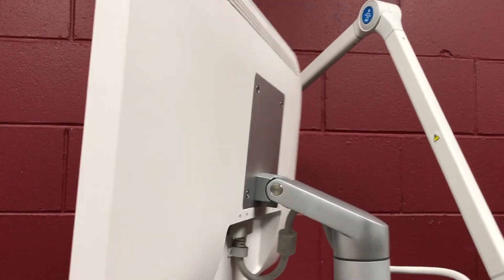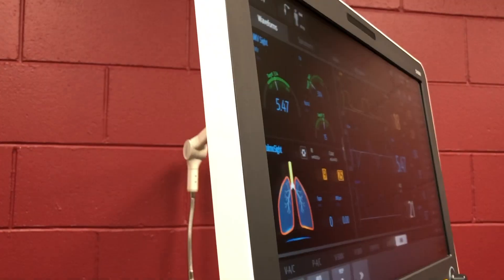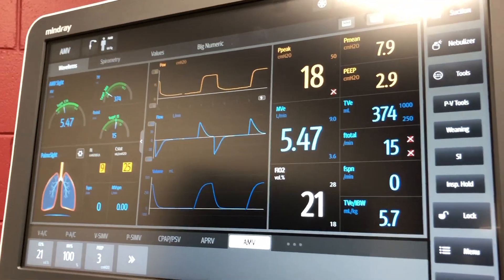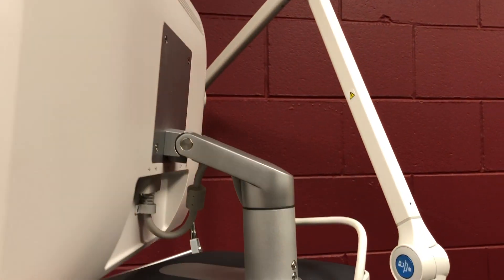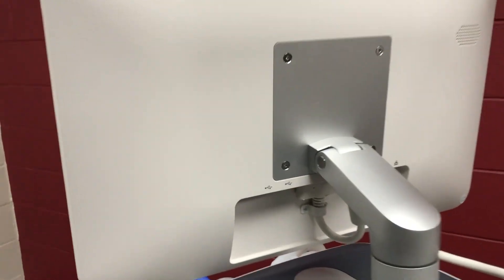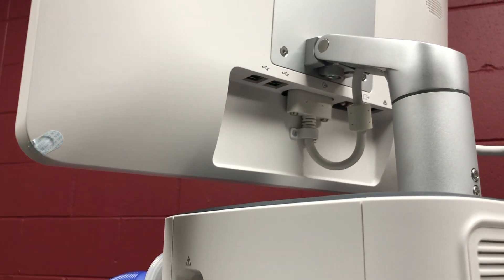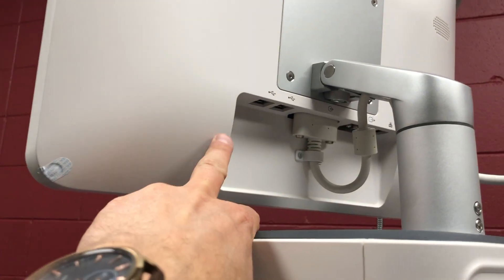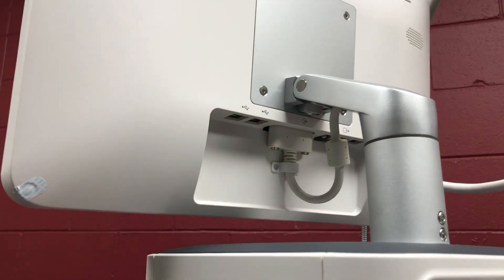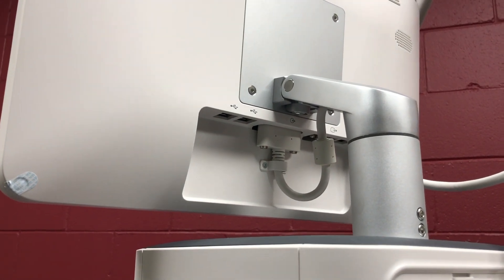The display is rotatable 360 degrees. Around the back of the display unit there are some ports up underneath for data and for USB — USB if you want to export data as well as run an ultrasonic nebuliser.